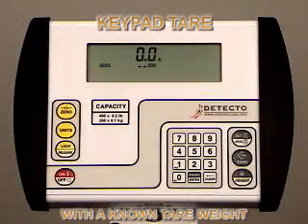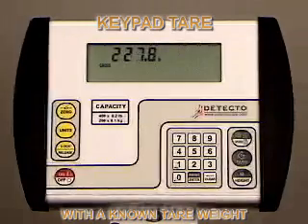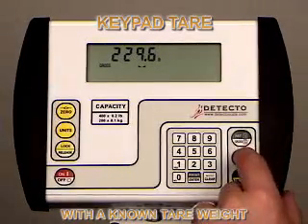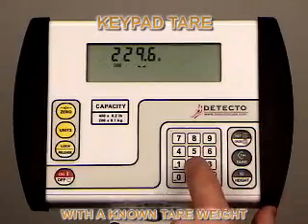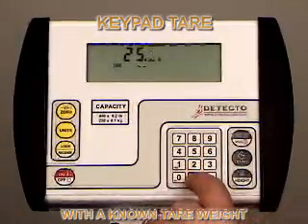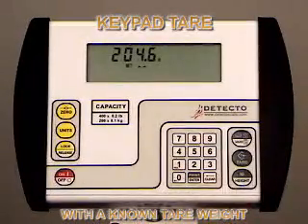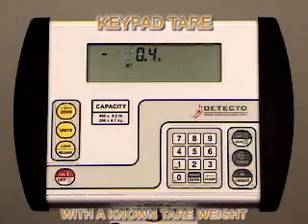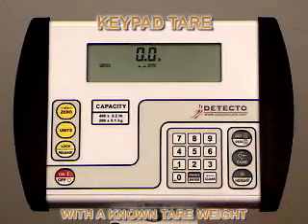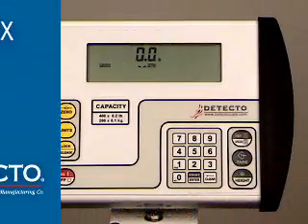For keypad tear with a known tear weight, place the patient and the wheelchair on the scale and press the tear key once to enter tear mode. Using the numeric keys, type in the tear weight and press the enter key. In this case, the wheelchair weighs 25 pounds. The indicator will enter net mode displaying the weight of the patient only, 204.6 pounds. Remove the patient and the wheelchair or walker. The indicator will display a negative net weight. Press the gross key to return to normal weigh mode.